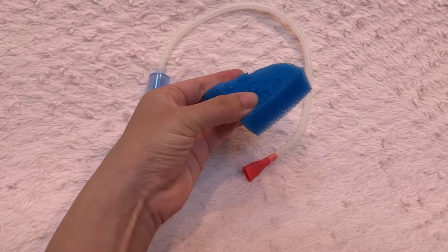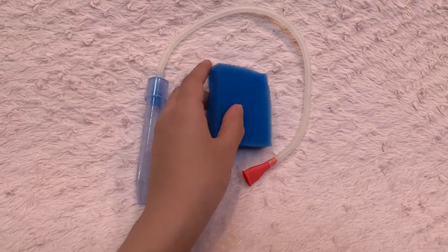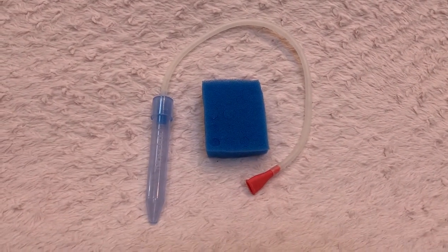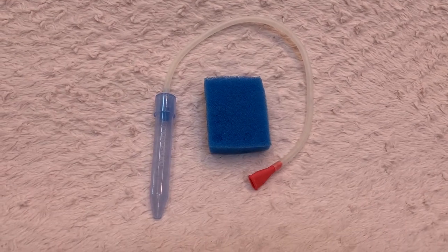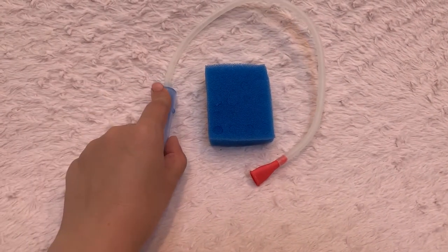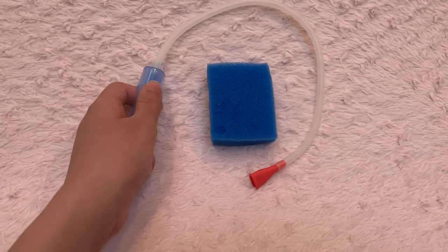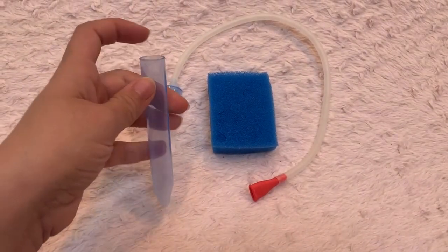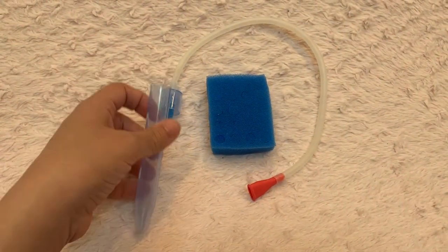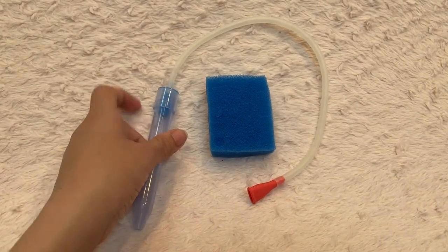It comes with filters — if the filter gets dirty you'll need to change it, but you won't have to change it every time, maybe every few uses. Every time I use it I run hot water through the tube to clean it out and let it air dry for the next time.